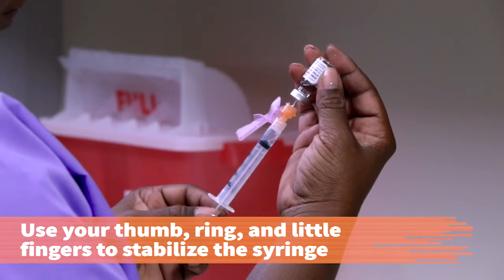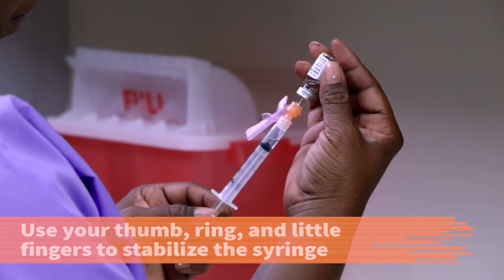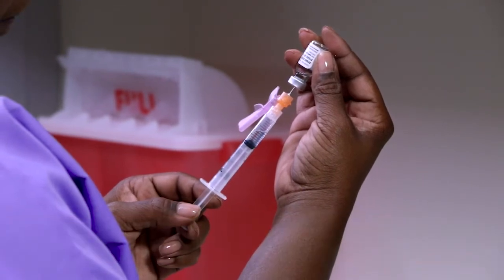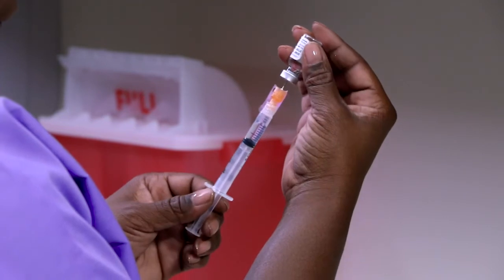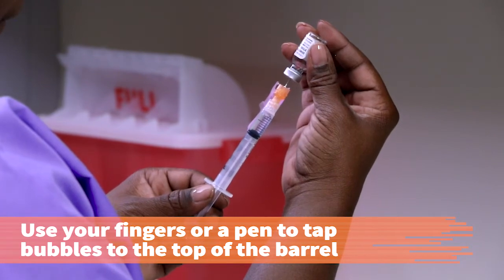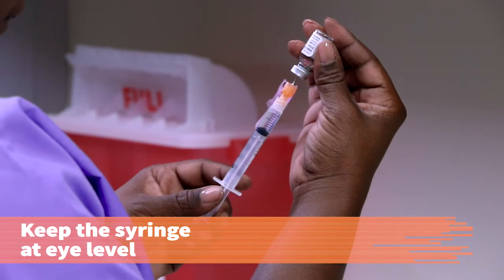Use your thumb, ring, and little fingers of your non-dominant hand to stabilize the syringe in the vial. Pull down on the plunger until you have more diluent than what you need. Continue to hold the vial and syringe unit in a vertical position with the needle pointing upward. With your dominant hand, use either your fingers or a pen to tap the bubbles to the top of the barrel. Keep the syringe at eye level.